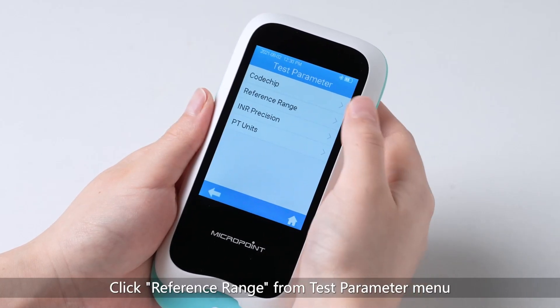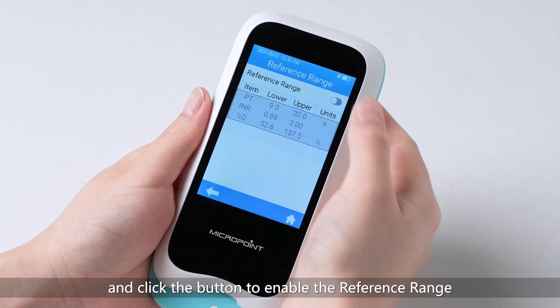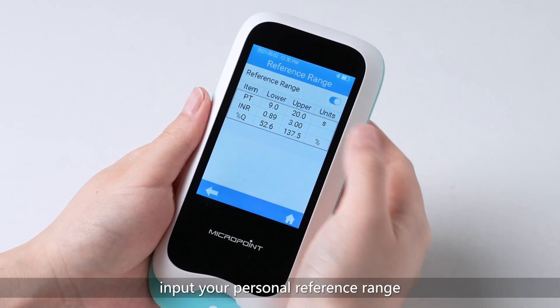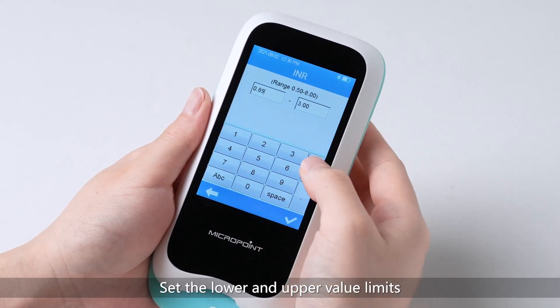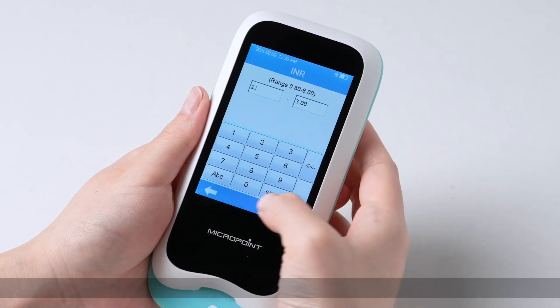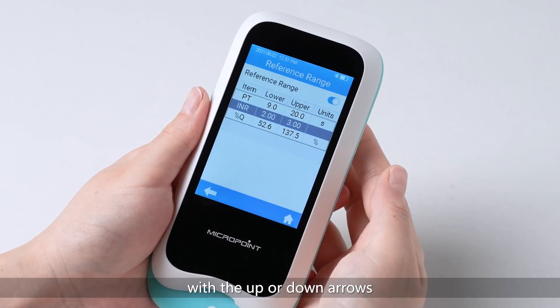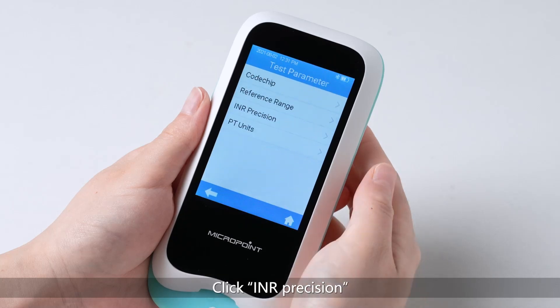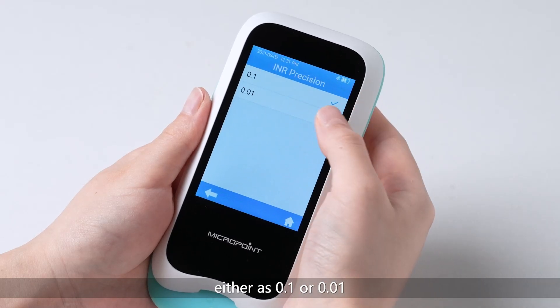Click Reference range from the Test parameter menu and click the button to enable the reference range. Input your personal reference range according to advice from medical care providers. Set the lower and upper value limits and click Check to confirm. Test results out of the range will be displayed with up or down arrows. Click INR Precision from the Test parameter menu to set the number of decimal points preferred, either as 0.1 or 0.01.